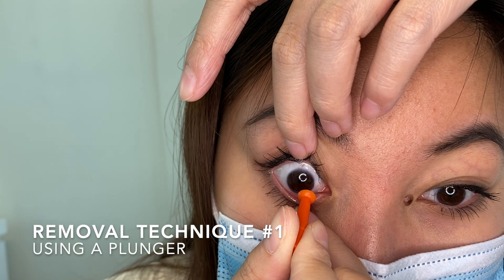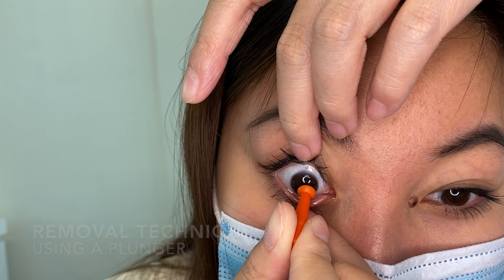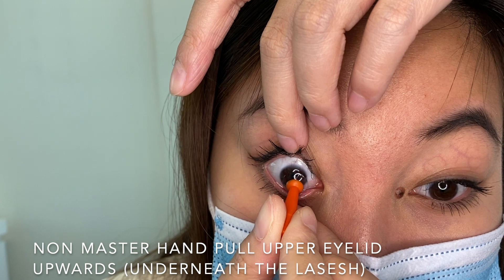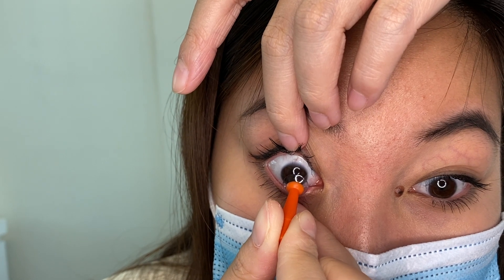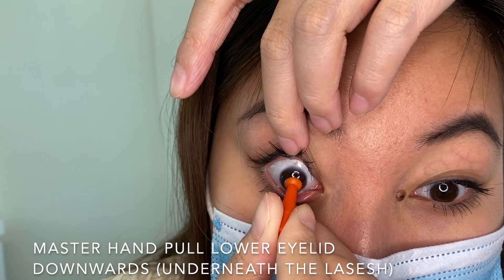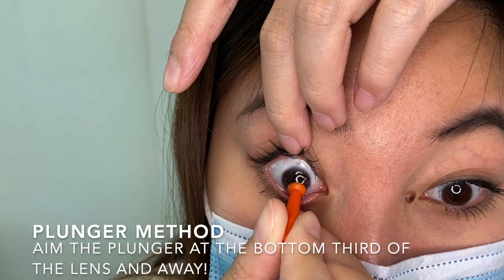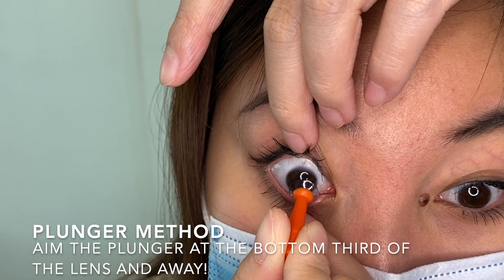There are a few methods for removal of the lens. The first method is called the plunger method. Using your non-master hand, pull your upper eyelid upwards, exposing the white of the eye. Then use the middle finger from the master hand to pull down the lower lid, exposing the white of the eye. Aim the plunger at the bottom third of the lens and the lens will gently pop out.